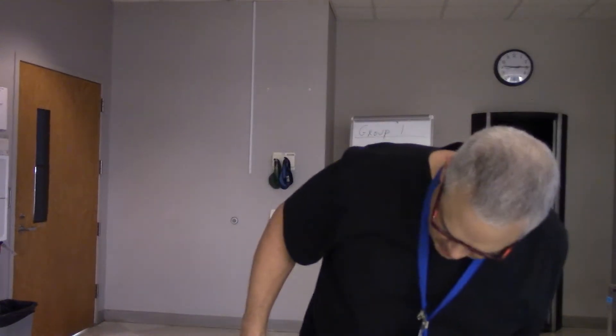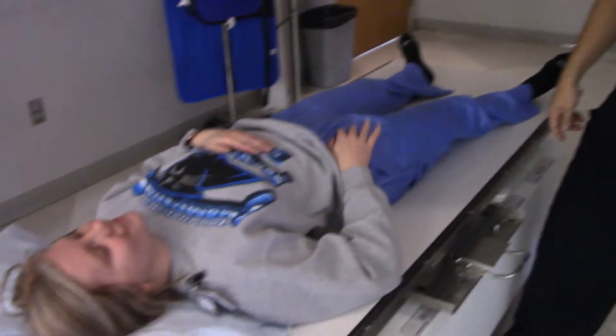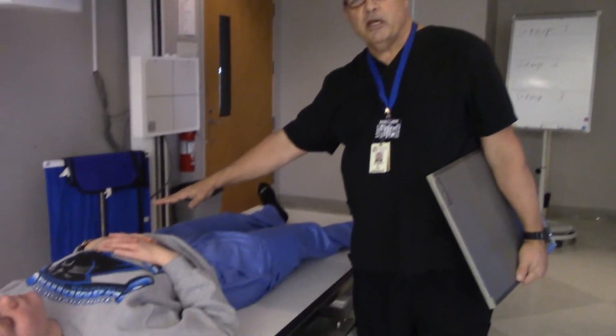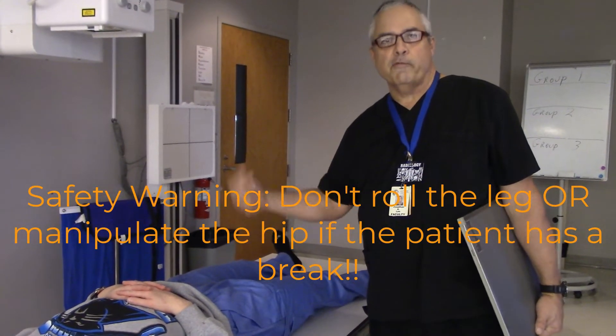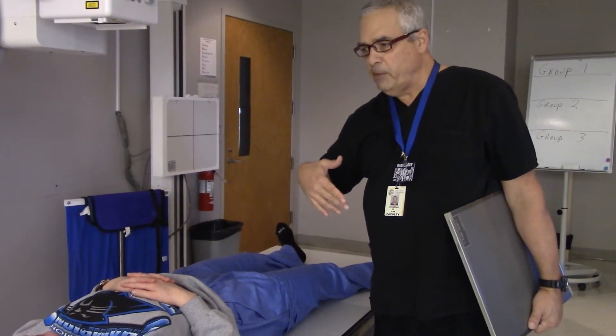We are now rolling. She broke her hip — she fell on the stairs. So what we are going to be doing, this is going to be a unilateral hip. I'm going to pretend like I have already got my pelvis taken care of, because generally when you get an order for a hip, you get an order for a pelvis to go with it. So let's pretend like I already got our pelvis x-ray.